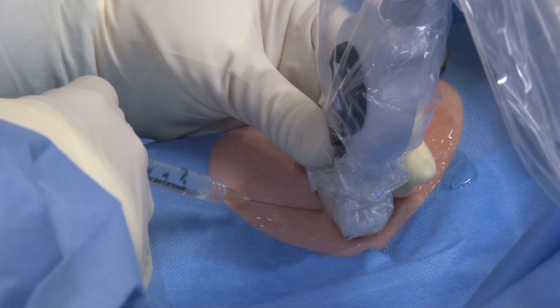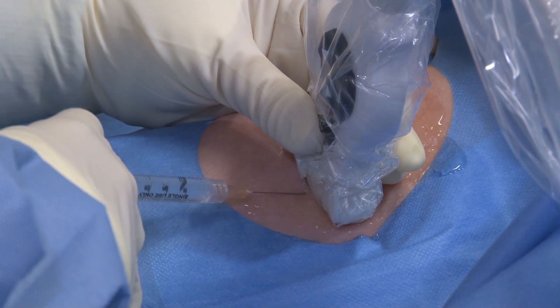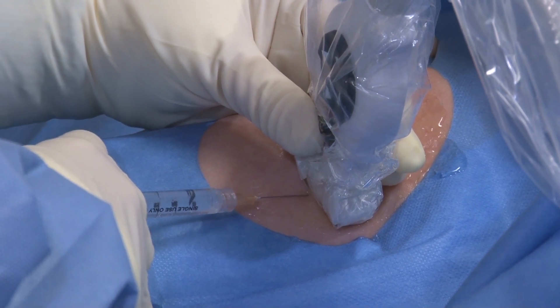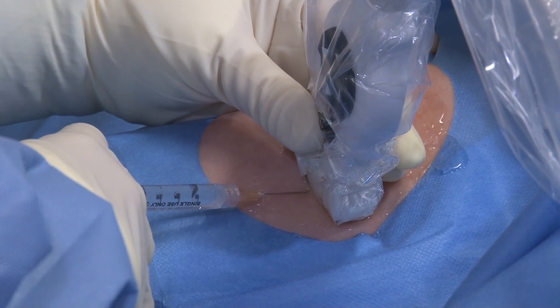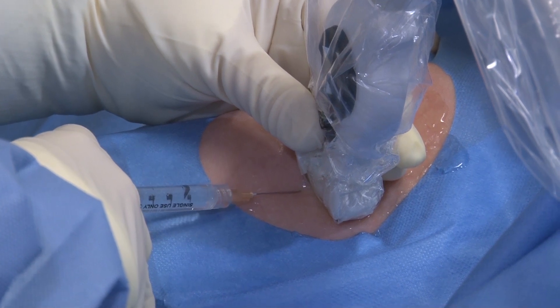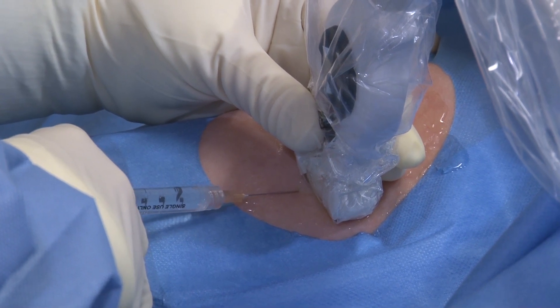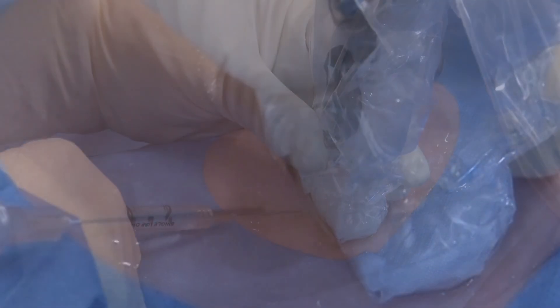A tract of local anaesthetic should be applied using ultrasound, infiltrating from the vessel edge towards the skin, producing a wheal at the surface.